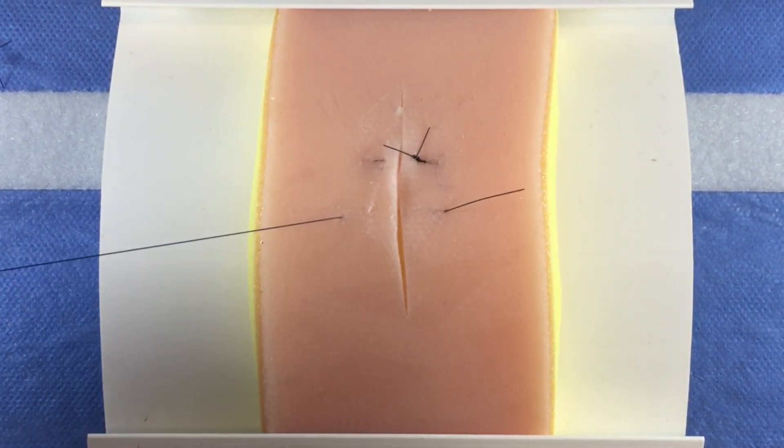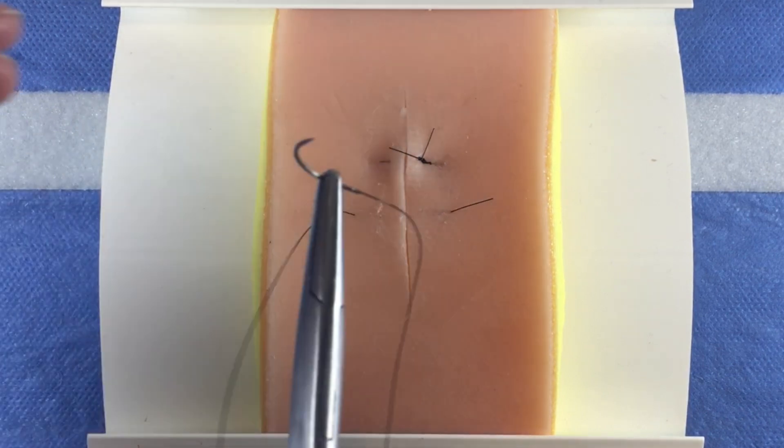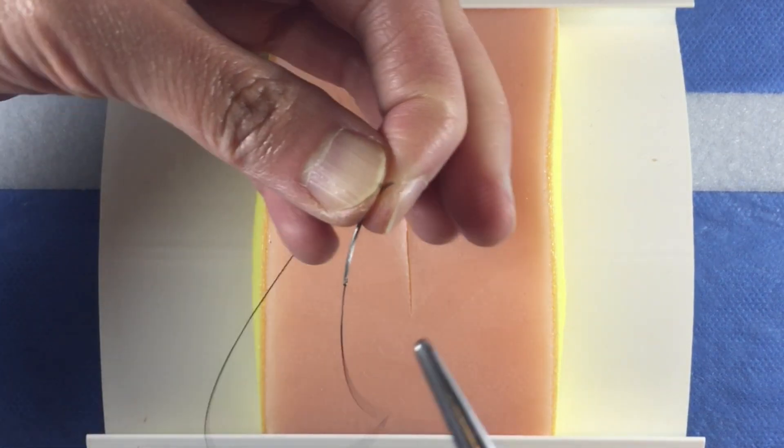Next, place a superficial bite in the same vertical plane as the deep one so that it is directly on top of the deep bite.